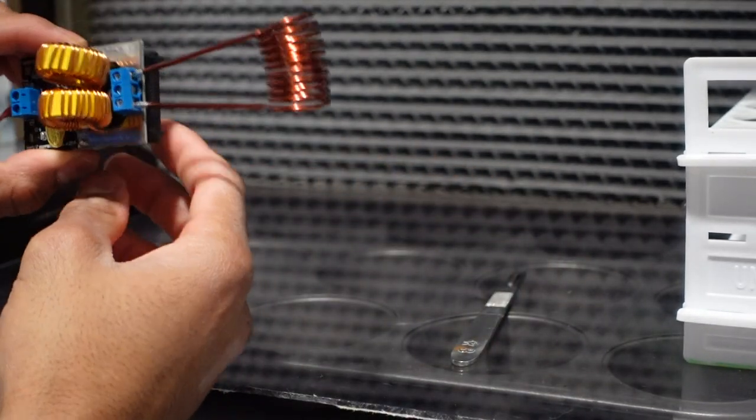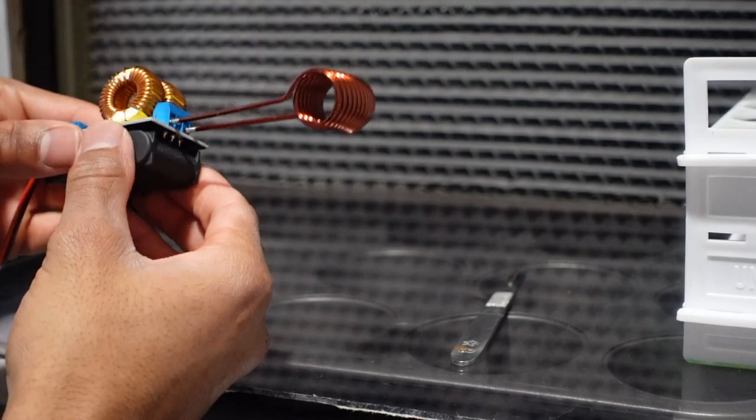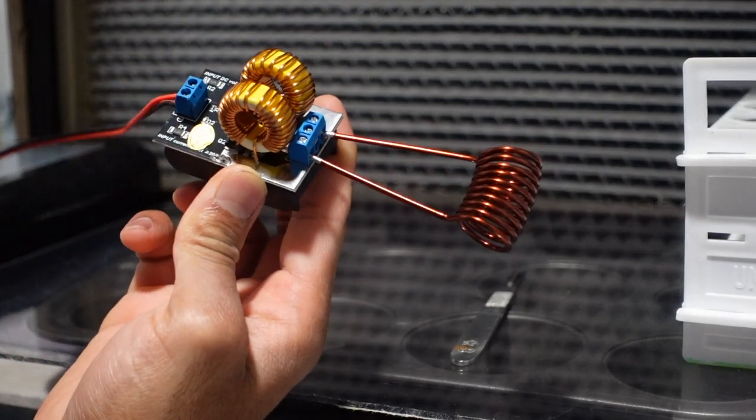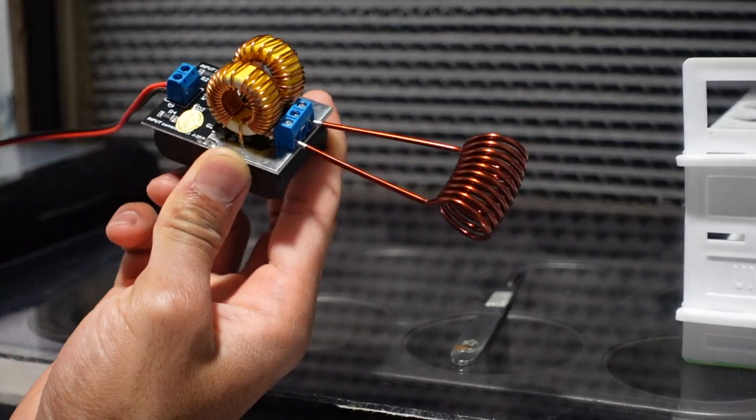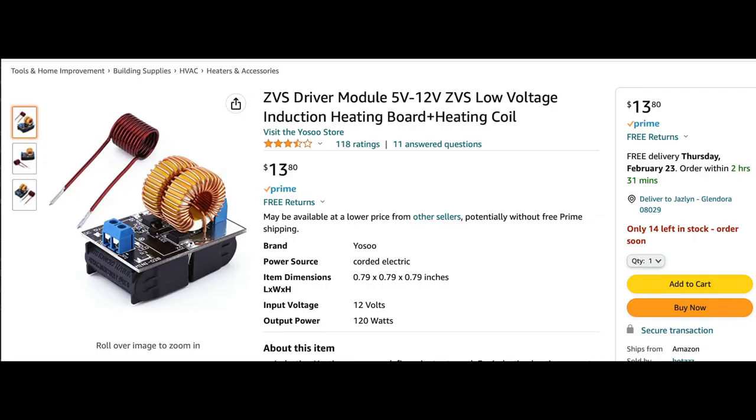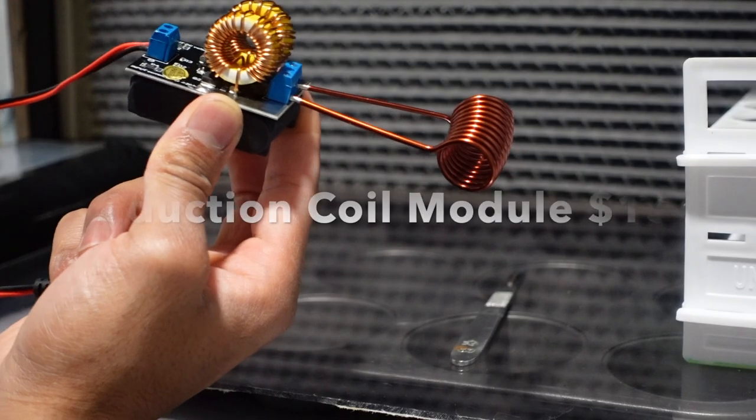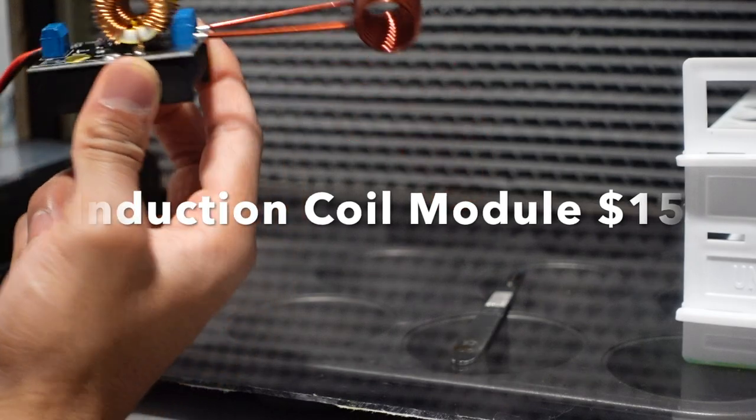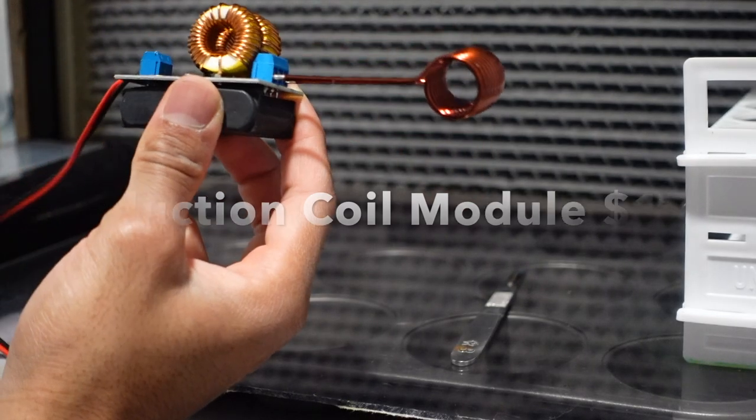So first things first, you need to buy this induction coil module. You can get them from anywhere as low as $10 to $15. I won't pay more than $15. In fact, I bought this one for $15 off eBay.